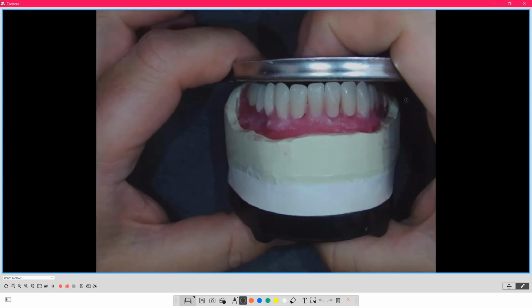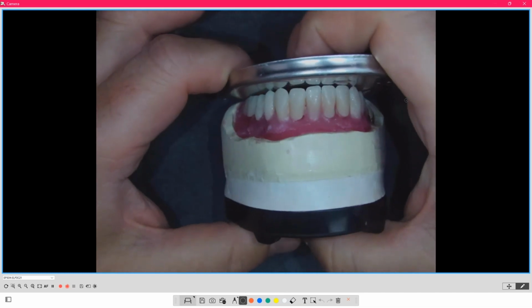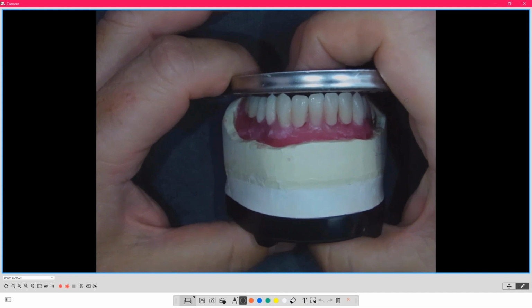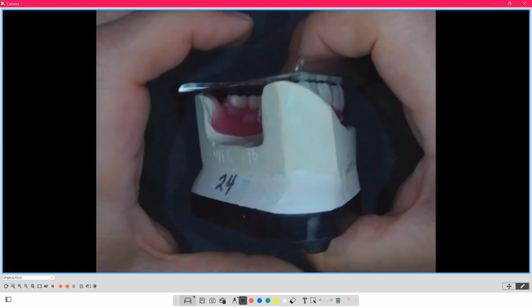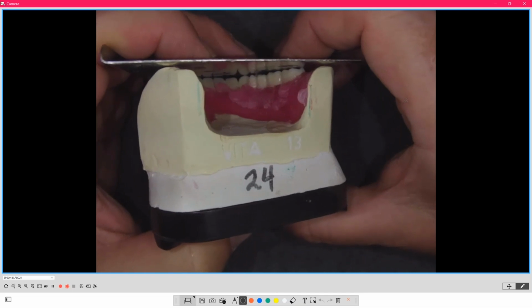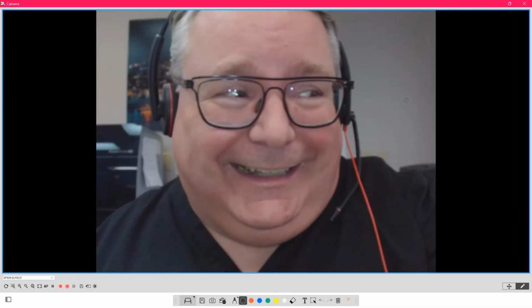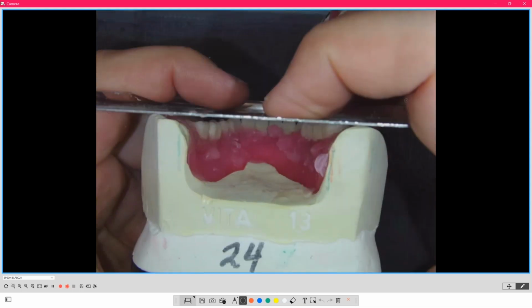The hesitation you hear in my voice is that sometimes I've had to angulate it, but that was because I saw it in the patient, and I knew there was a tongue issue, or just something told me that I needed to put the buccal up a little bit and tip that lingual down, just because of the way their tongue was moving. So there are some exceptions to the rule, because again, I've never met a textbook patient. So remember, some of us like ketchup on our scrambled eggs. And some of us don't, but that just makes us unique. So that's what this is.